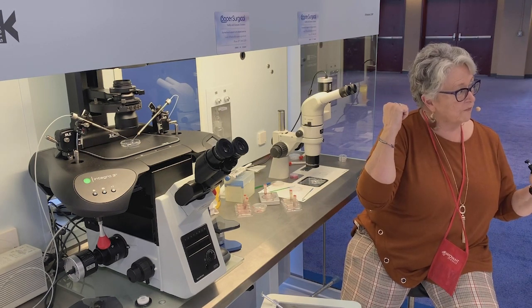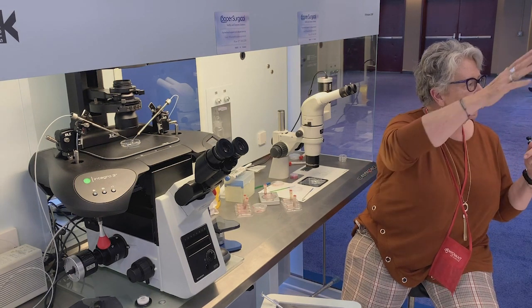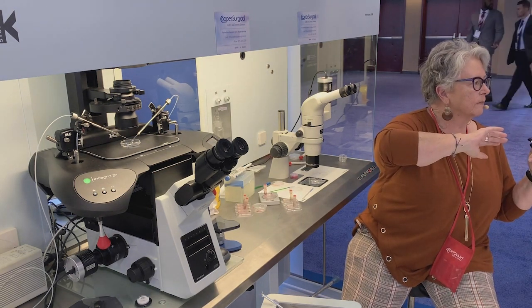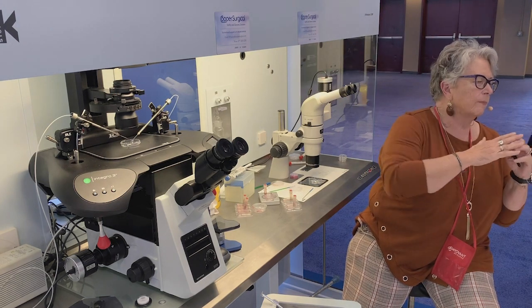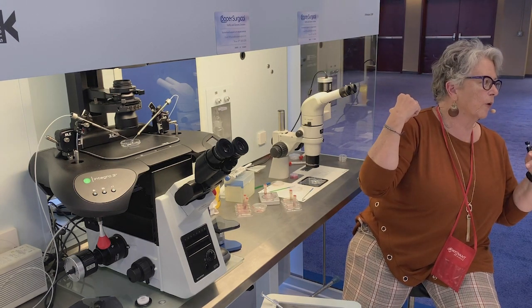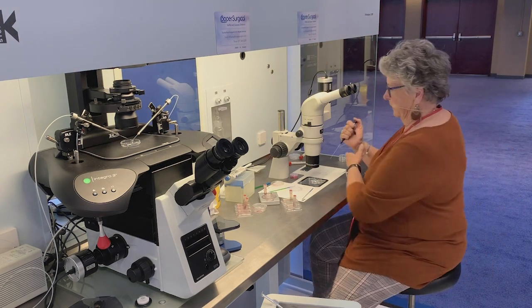So it's faint on my scope. Sorry if it's not showing up on there, but it's in. Okay, you can see it? You can see it, great. All right, so we put it in. You don't have to spend any time. Here, we're not going to go the whole 8 minutes, but at the end of 8 minutes, you'd pick it up and move it.